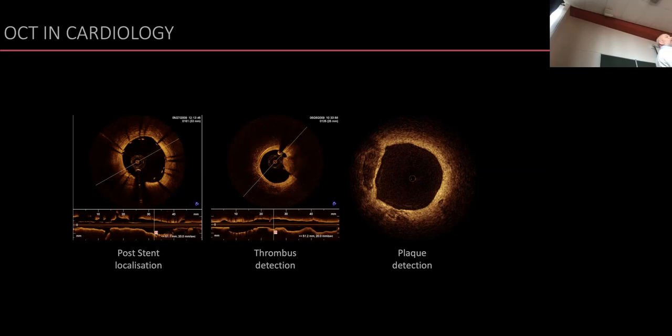But what you can bring down is a guide wire that you can see during X-ray imaging, so you know where you are. And usually they bring it down somewhere downstream. In your femoral artery, for example, you go in here, and the bloodstream itself guides the wire to the heart. And then when you end up at the heart, you can steer it by twisting this wire a little bit to make sure it goes into the right artery. That's what they do, and they're super handy in doing that. That's the trick that they do. So this is the guide wire. This is metal, we cannot look through it, so that's why you have the shadow.